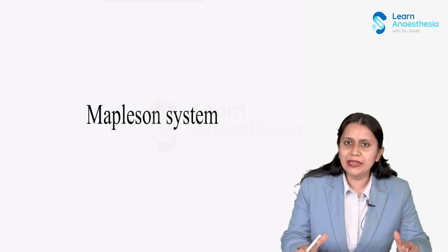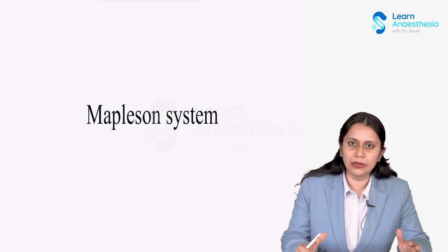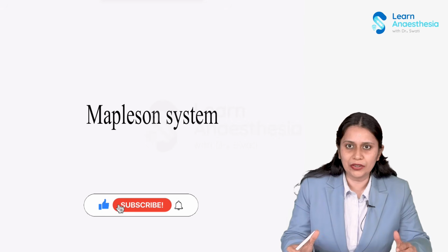What is the work of breathing system? The work is to bring the inspiratory gas towards the patient from machine and to remove the expiratory gas away from the patient. Now, there are two important breathing systems which we need to discuss. One is the Mapleson system, which I will discuss in this section, and the other would be the circle system, which I will discuss in the next section. So, let us talk about Mapleson system.